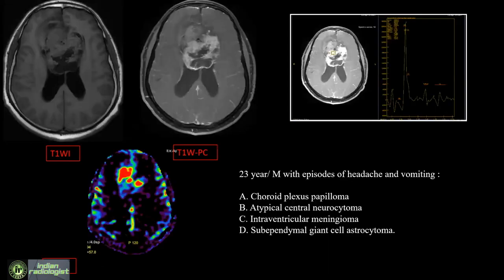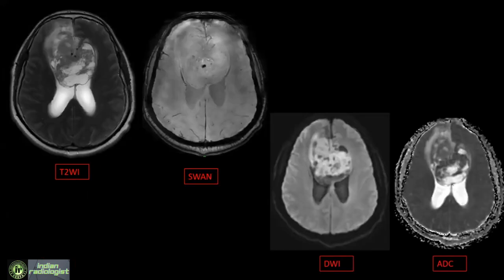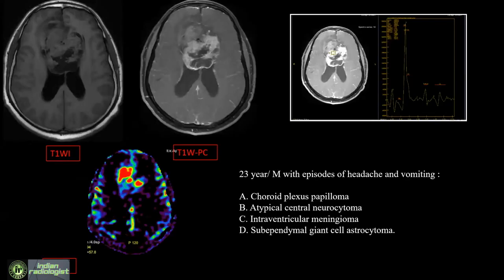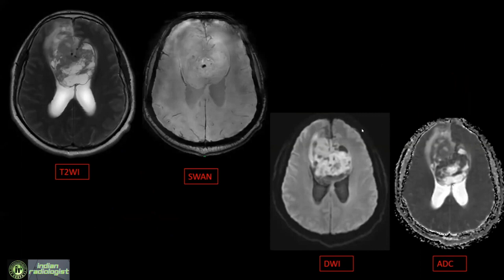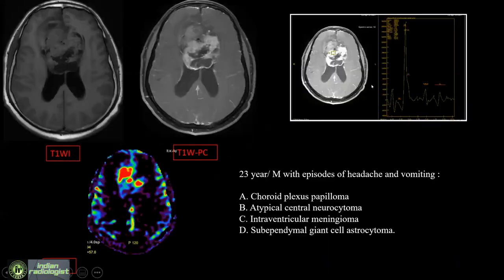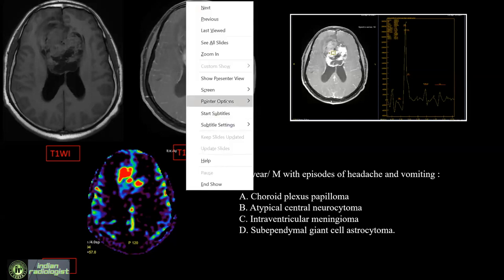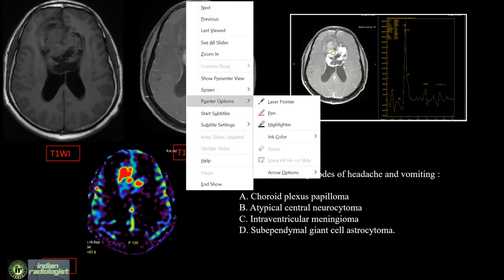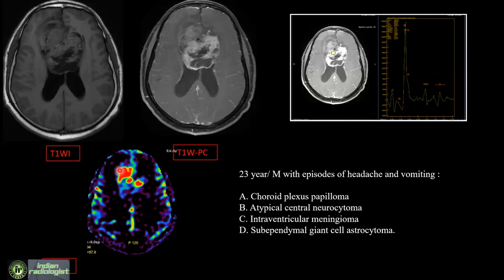Next question: a young 29-year-old male with complaints of headache and vomiting. You can see the images including a colorful ASL non-contrast perfusion image assessing areas of hyperperfusion within the lesion, post-contrast T1, and pre-contrast T1.